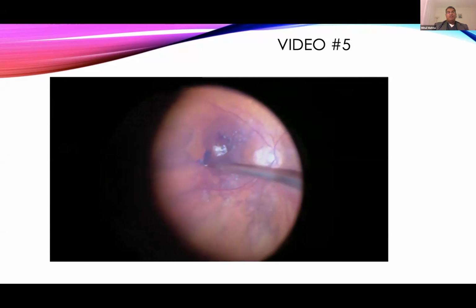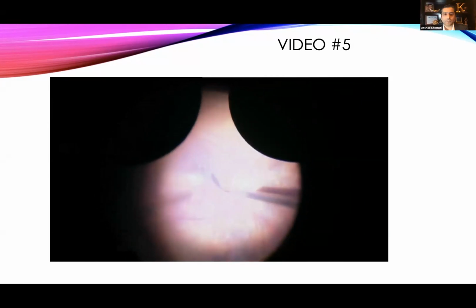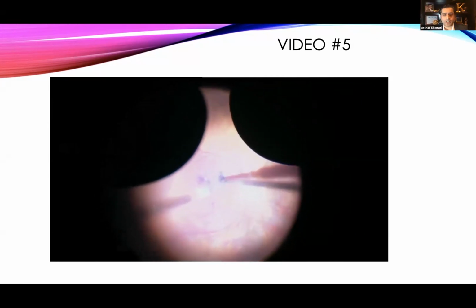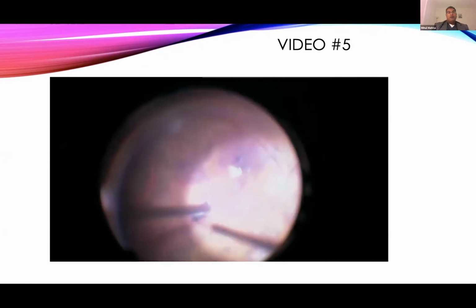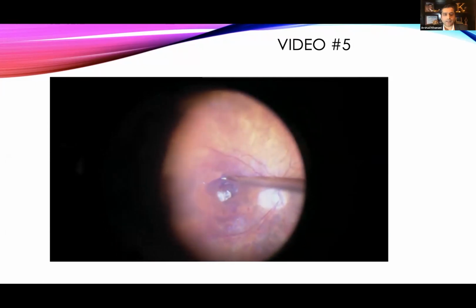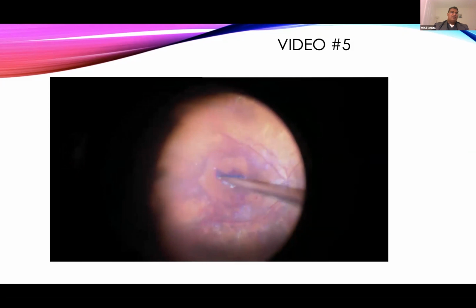Okay. But this was, again, using the soft tip and trying to not. Beautiful stain, by the way. Great job. Did you stain it only once? Stained only once, but 45 seconds this time. Nice. So you're better than Carl. He does 1 minute, you do 45 seconds. How long does it really take?